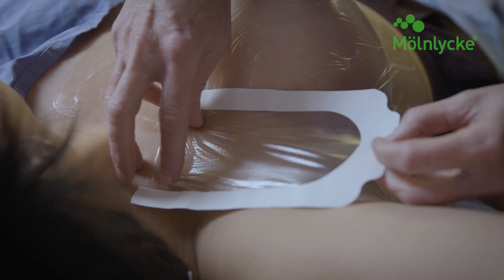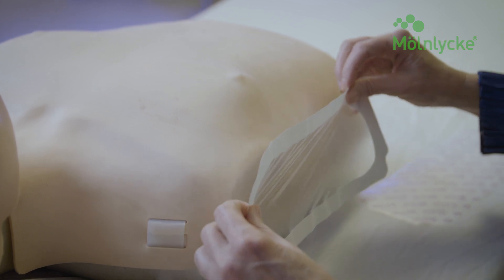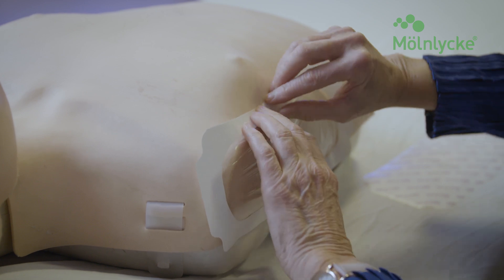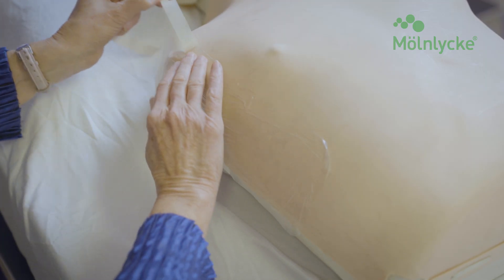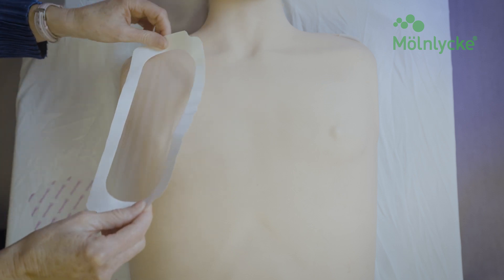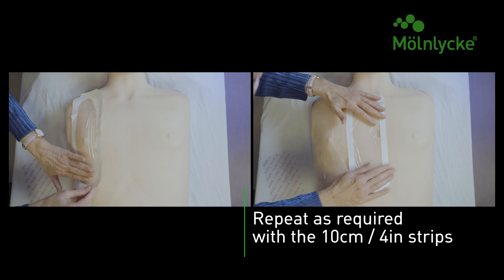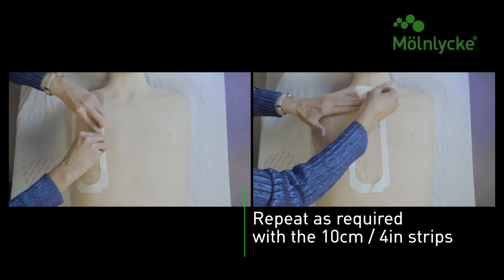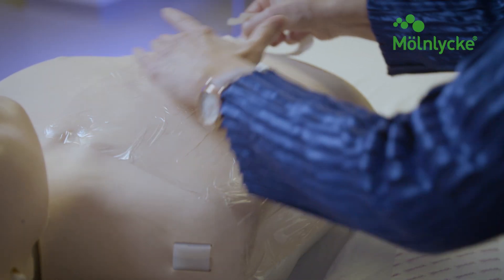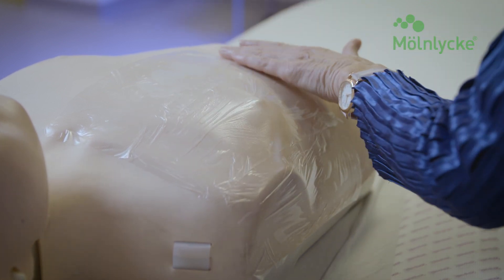For mastectomy patients, begin the application using the entire sheet of 10 x 25 cm dressing, starting at the clavicle and laying the film straight down to the upper abdomen where the inframammary fold would end. Continue applying the film working from the axilla area to the mid-sternal area, extending the dressing about 2.5 cm beyond the tattoo mark. Finish applying the film starting above the clavicle and extending down the chest wall, working medial to lateral, ensuring the entire mastectomy area is covered.